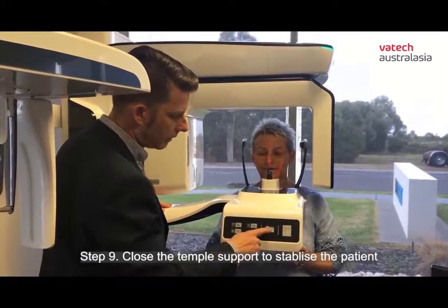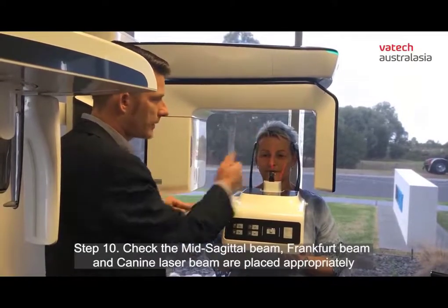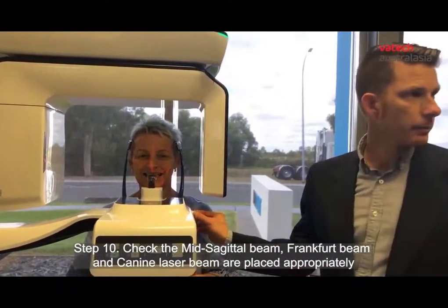Next, I'm going to go ahead and close my temple supports. It does move the patient a little bit, so I always double check my mid-sagittal beam. Then I'm going to step over here and have them smile again, and I line this right up to the center of our canine.